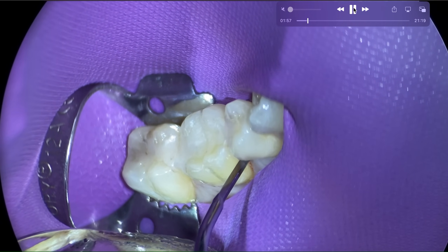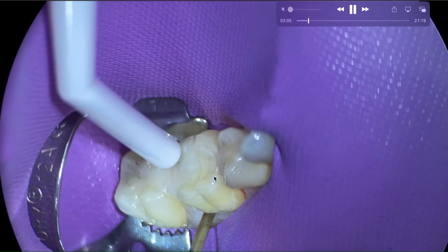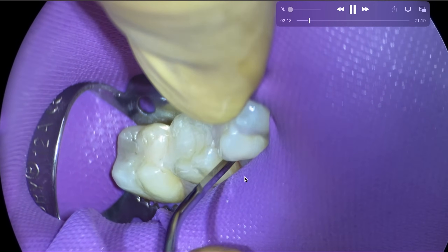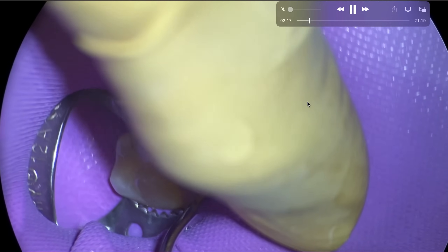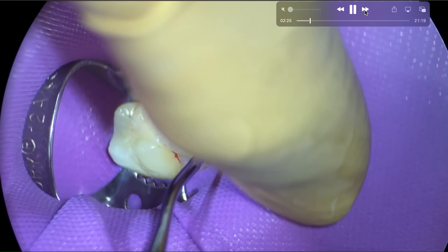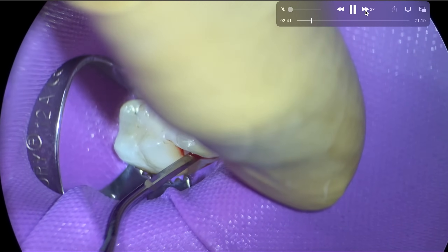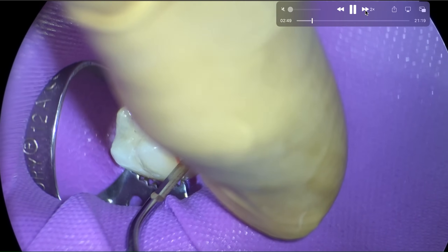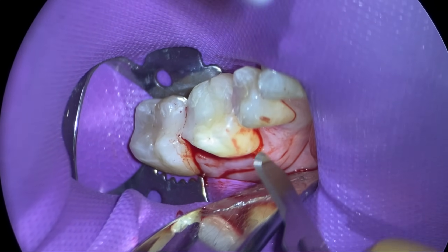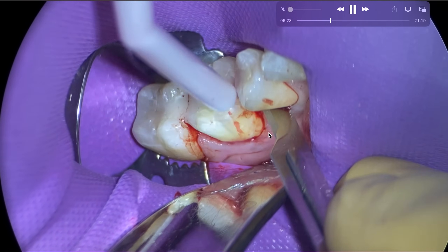The strategy for extracting endodontically treated teeth or heavily restored teeth — this is both — is that if you place your forceps on the crown, it's going to fracture into a thousand pieces. So we're going to plan to section it right off the hop. But before we do that, we're going to induce a little bit of hemorrhage in the PDL and see if we have some mobility. We're just using some peritomes to induce some hemorrhage along the PDL and create some space. Then we're going to use our 77R elevator. Next up, we're going to sever the interpapillary papilla fibers, which helps to elevate the papilla without tearing it.